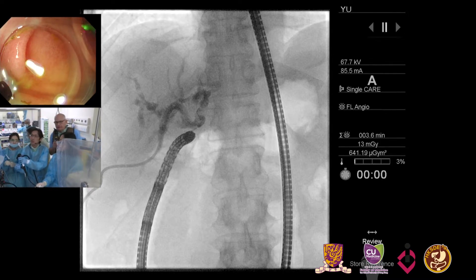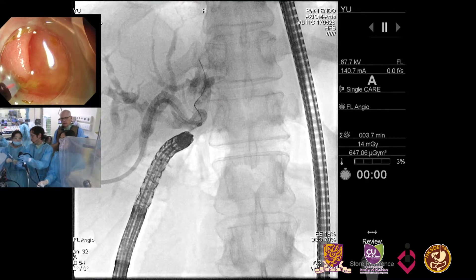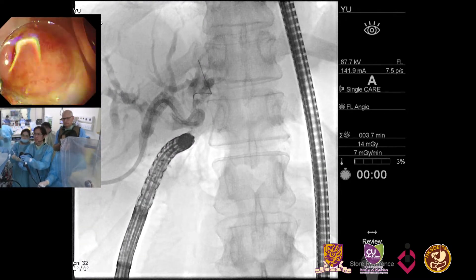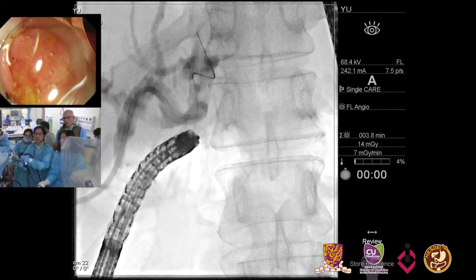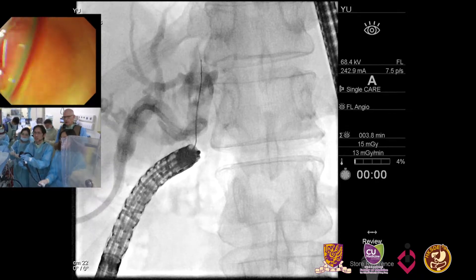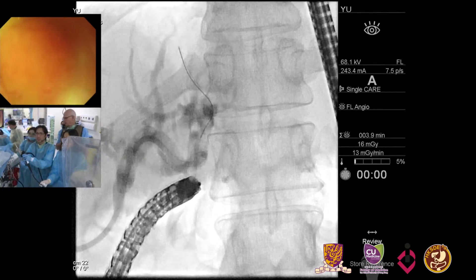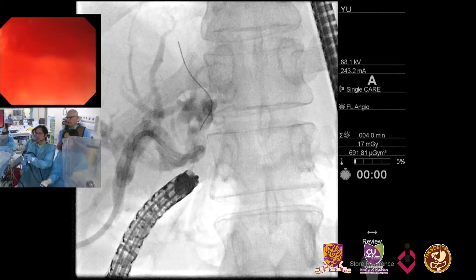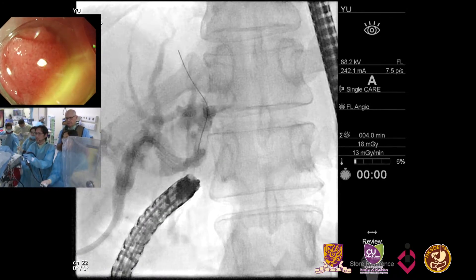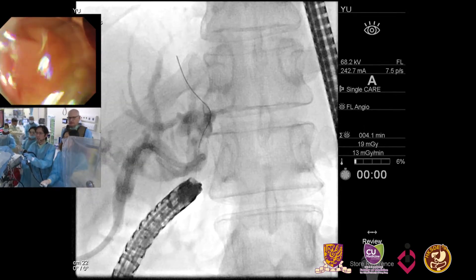Six millimeter balloon. Do you have enough wire in? Let's put in a little bit more. Let's exchange for balloon dilation. Whenever you're working over a guidewire, you want to make sure you work over the stiff part. Raymond now has more of the stiff part of the wire in — that's even better. We'll proceed to dilate with a six millimeter balloon.